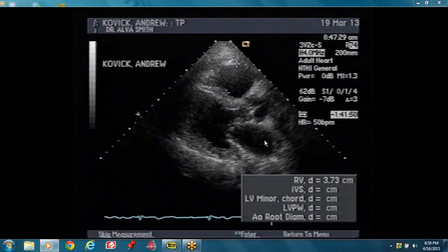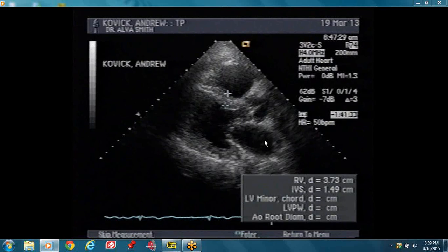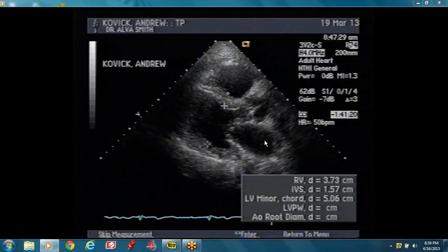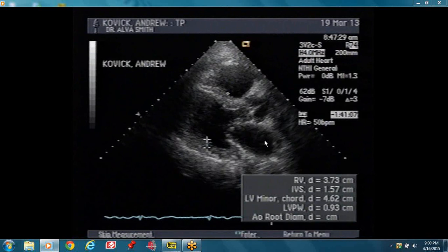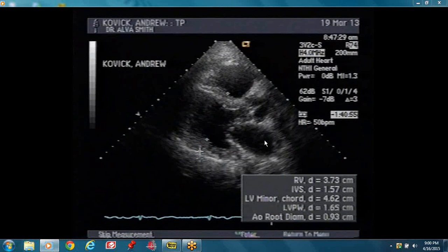We'll measure the RV cavity and the right ventricular outflow track, then measure the septum. This is in diastole — the aortic valve is closed and the mitral valve is open. You measure the septum thickness, LV cavity size in diastole, and the posterior wall thickness. You need to know whether this is left ventricular hypertrophy or not, because LVH carries a prognosis — it's not a benign condition. You have increased arrhythmia and related issues.